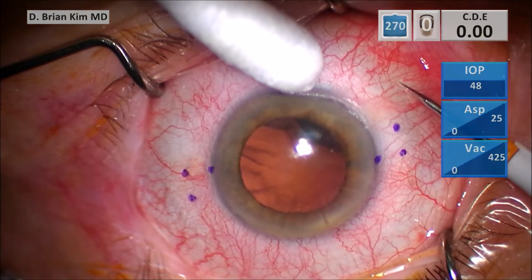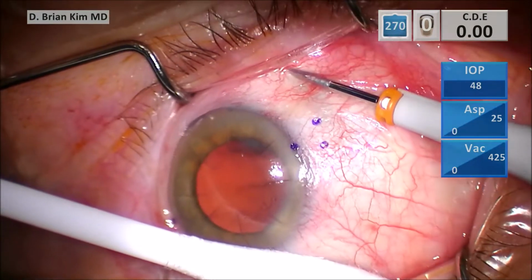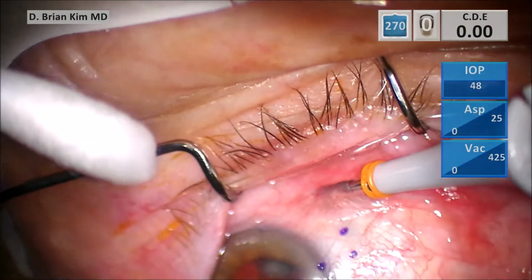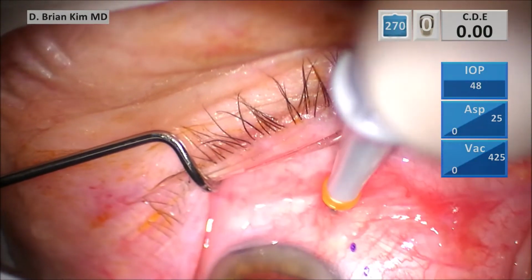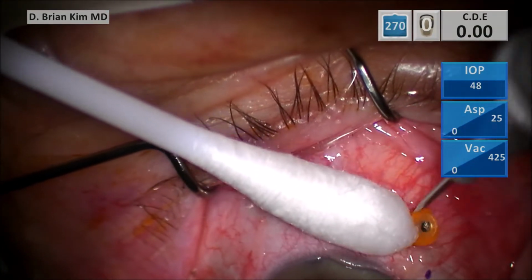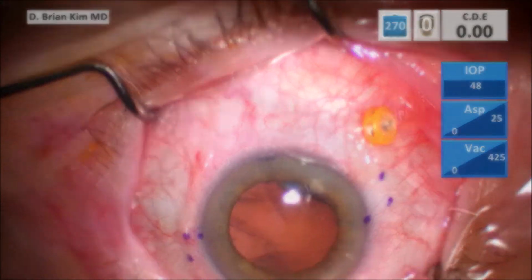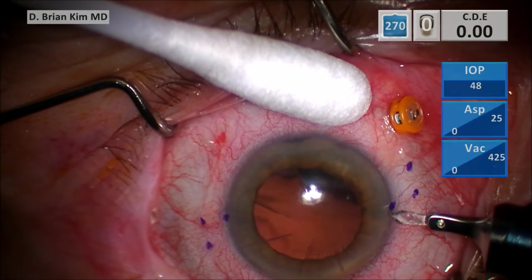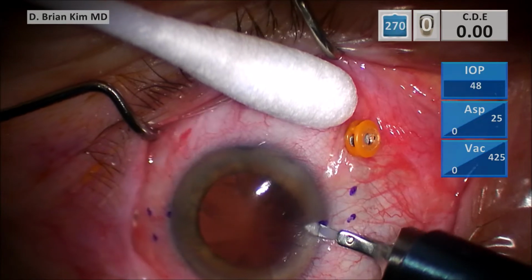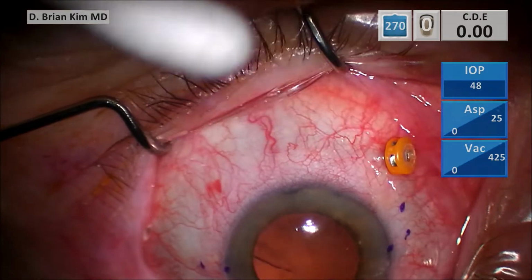I'm going to move the conj, and then with tangential forces, I'm going to tunnel through the sclera, tunnel 3 millimeters or so, and then I'm going to turn vertical, perpendicular to the surface of the sclera, and then I push down. Use the cotton tip to hold the trocar in, take the needle out, and now I'm right underneath the lens. And so this is really cool. I go ahead and make my other incisions here, first on the right side and then the left side, which are going to help me to grab the lens and pop it up into the anterior chamber so I can cut it out.